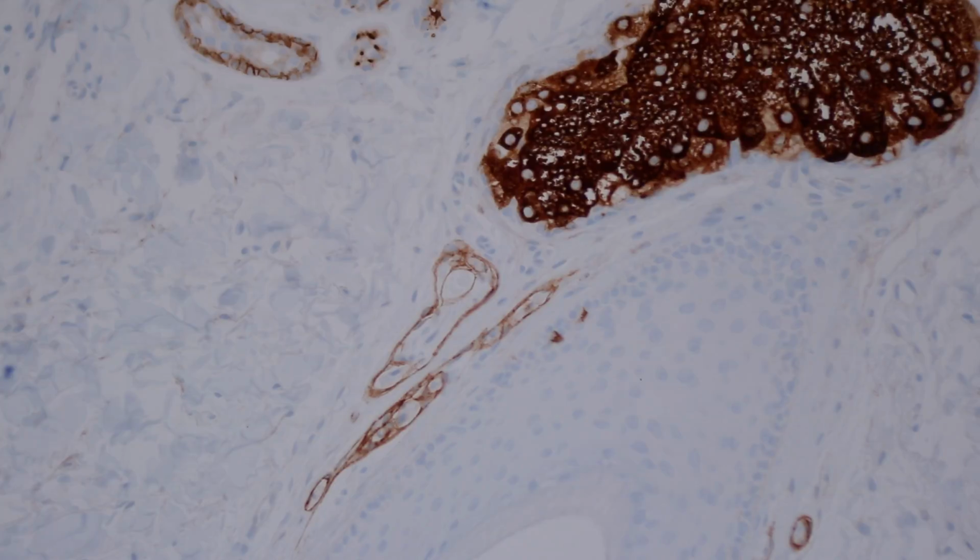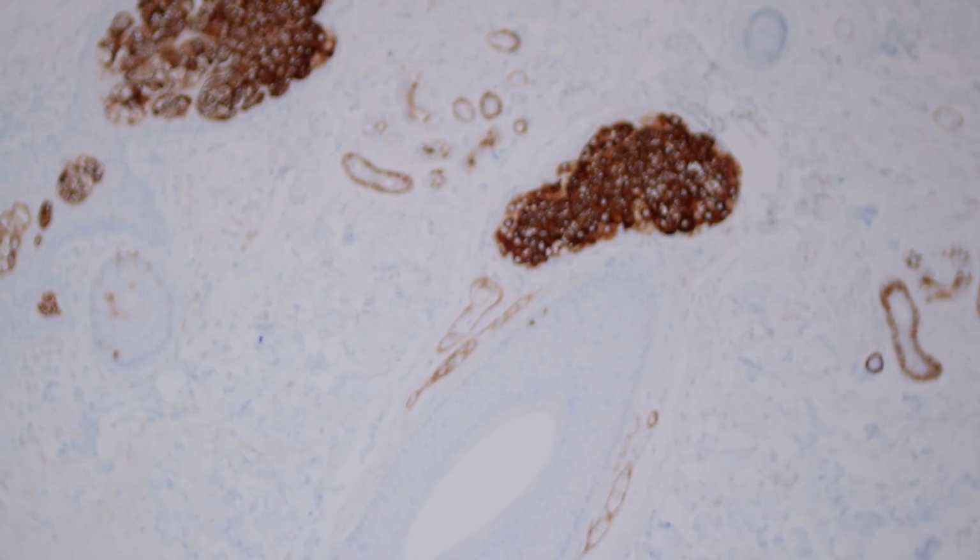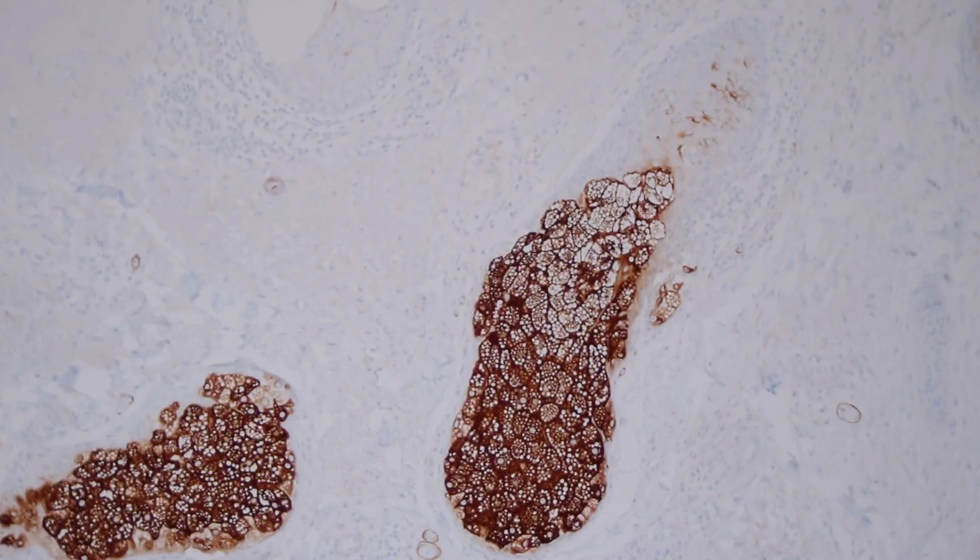So we use those in soft tissue pathology when we're looking for perineurioma, and again, you can use them here as a nice example of a background control, an internal control to show you that the EMA stain is working. So that's a pretty nice example of that. So that's EMA in the normal skin. Again, one last look at the beautiful sebaceous glands. Very, very pretty. All right.